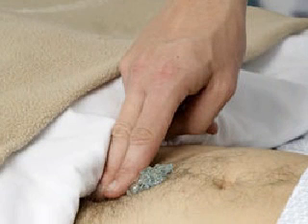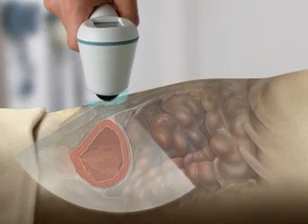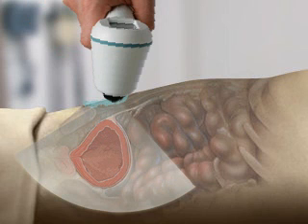Palpate the patient's pubic bone and place an ample quantity of gel midline on the patient's abdomen, about 1 inch or 3 centimeters above the pubic bone. Standing at the patient's right side, place the probe on the gel and aim toward the expected location of the bladder.